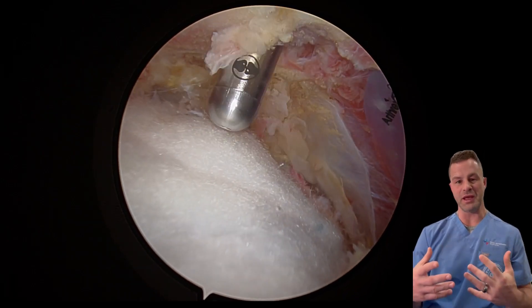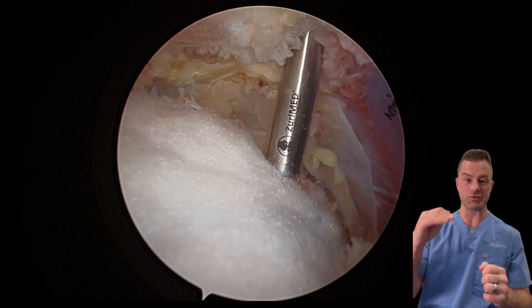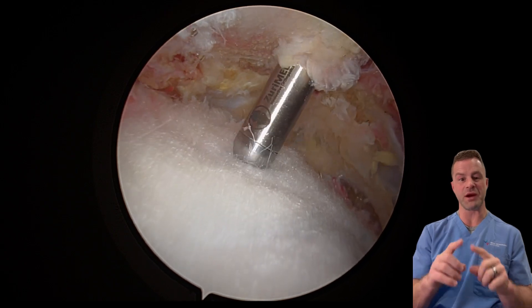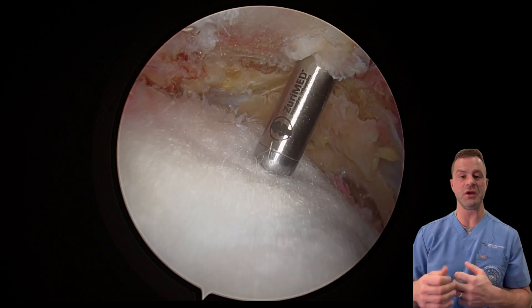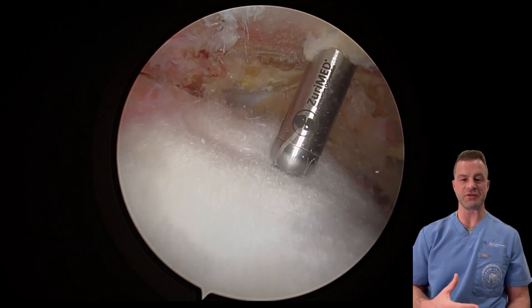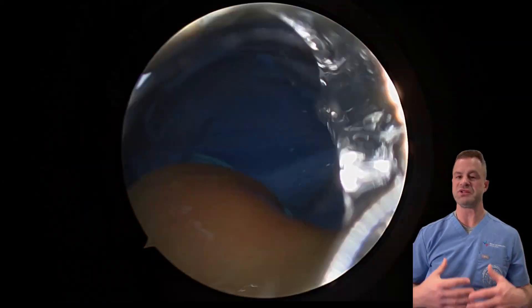This implant doubles to triples the actual strength of the repair at time zero — meaning when you fix it in surgery, because of the way it's designed, it allows for almost double to triple the strength of the rotator cuff repair. This now allows you to move your arm very quickly after surgery without having to worry about tearing the repair. You do not need to wear a sling after rotator cuff surgery — you can fully actively move your arm without worrying about tearing the repair, which is incredible.